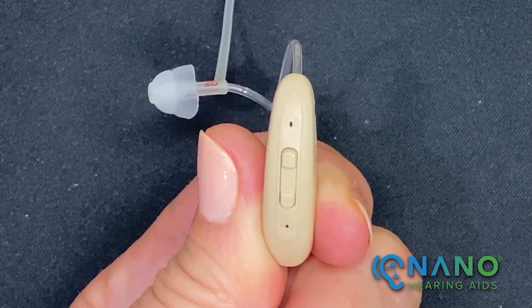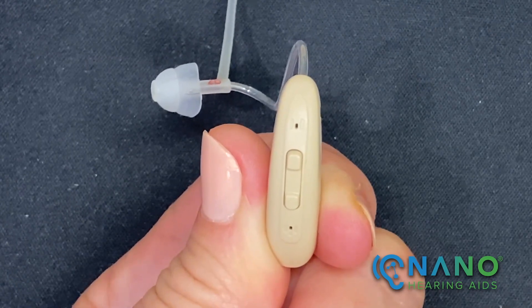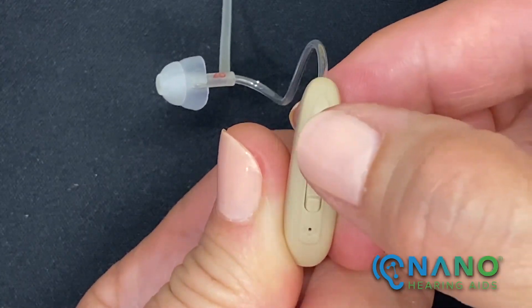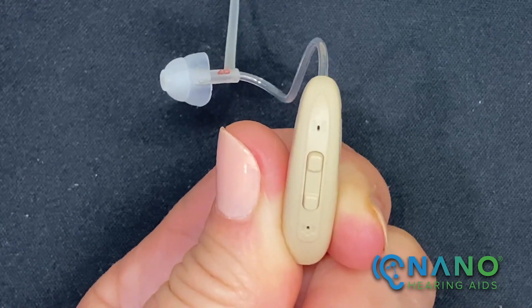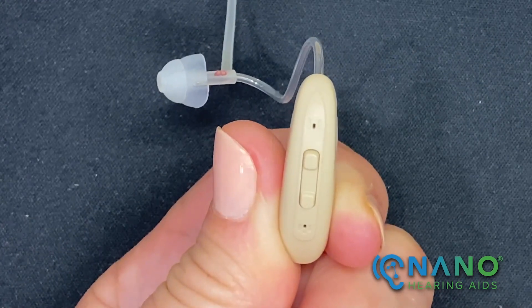To increase the volume, quick press the upper button to cycle the volume up from levels 1 to 10. You'll hear one beep every time the volume is increased, and three beeps when the maximum volume is reached.